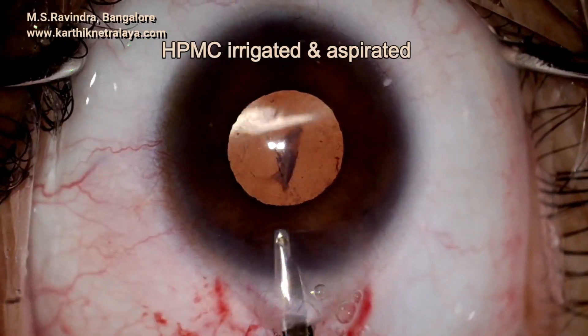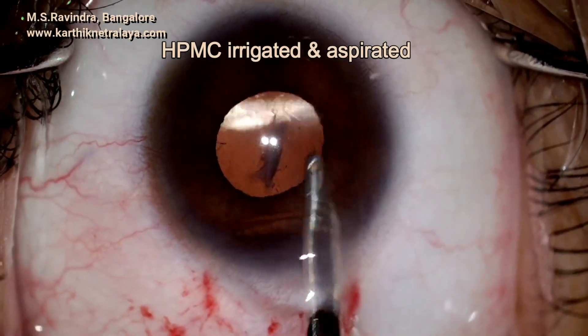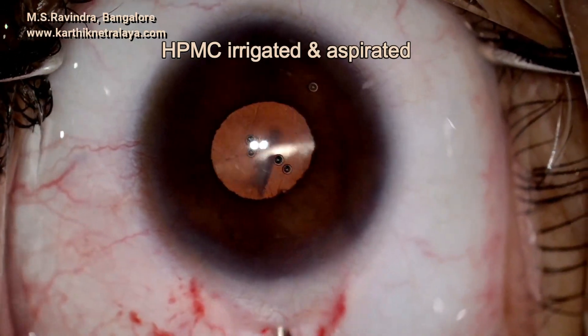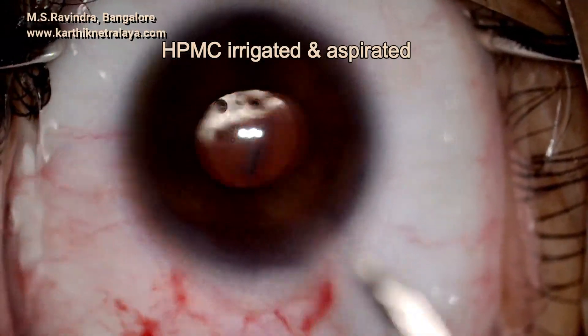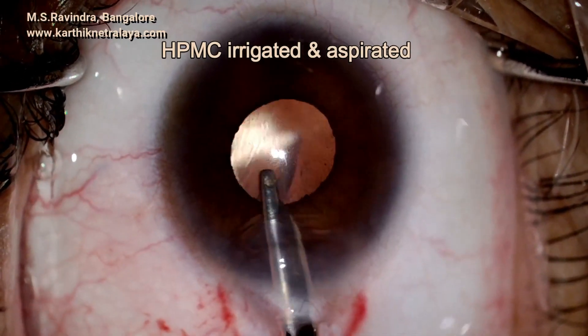The patient had wonderful vision and after a few days the other eye was also taken up for a similar surgery. As the tunnel is not stretched or heated during the surgery, there is no need for stromal hydration.